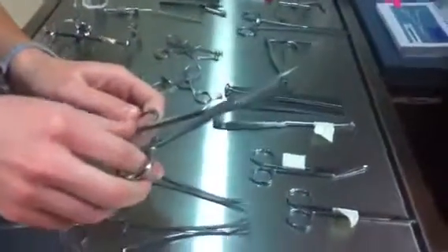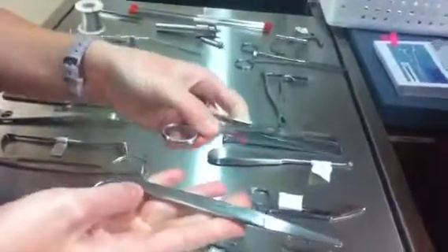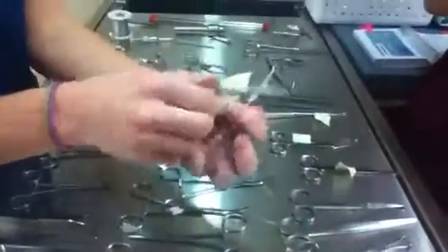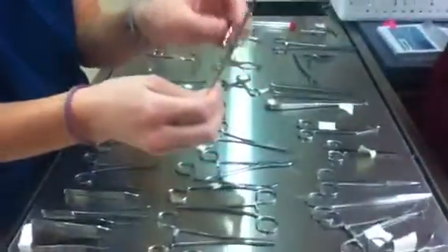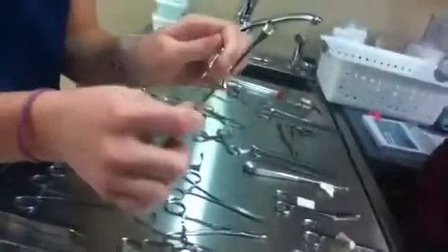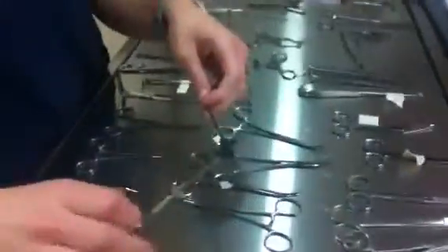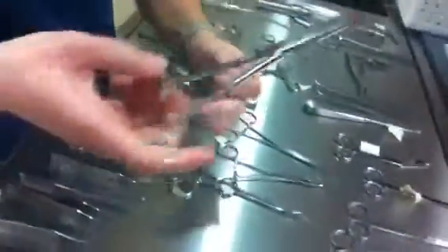These ones are just normal operating scissors, right? And these both are Mayo, because they're bigger. This is the Roeder Clamp. And this one is the Backhaus. And then this is the Allis Tissue Clamp. This is the Babcock.